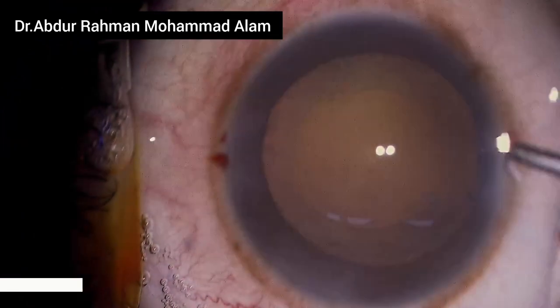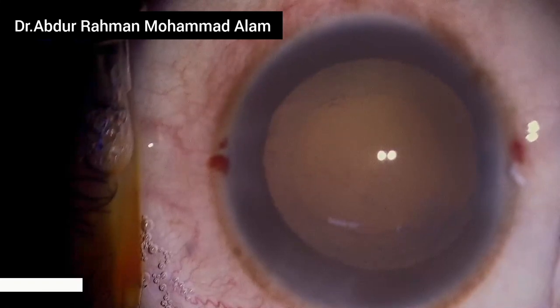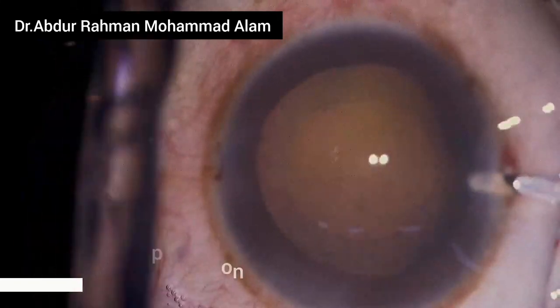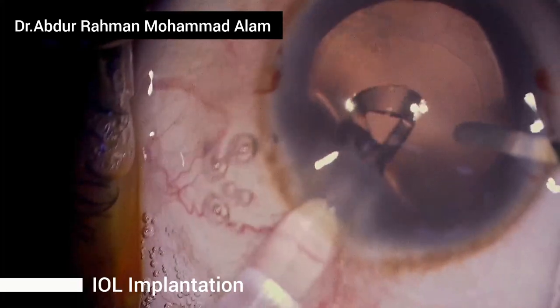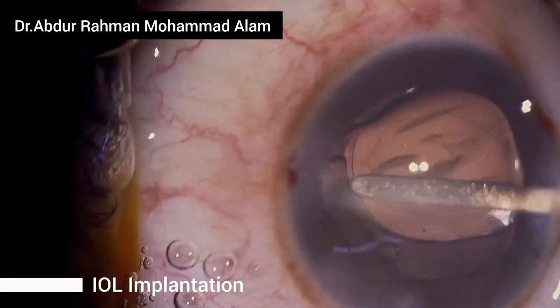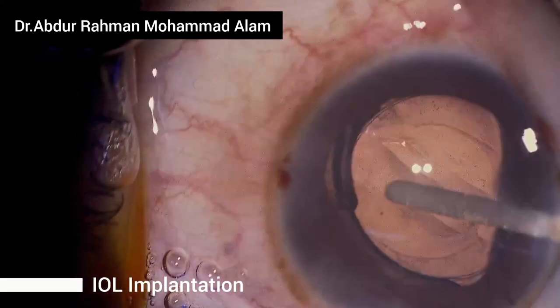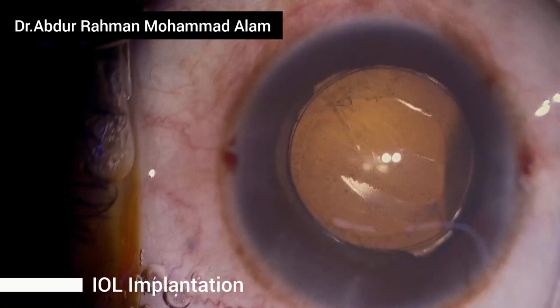Now stabilize the eye with the help of a spatula placed through the side port. Then inject the intraocular lens through the main port. Care should be taken that the leading haptic enters into the capsular bag, then dial the trailing haptic inside the posterior capsular bag.